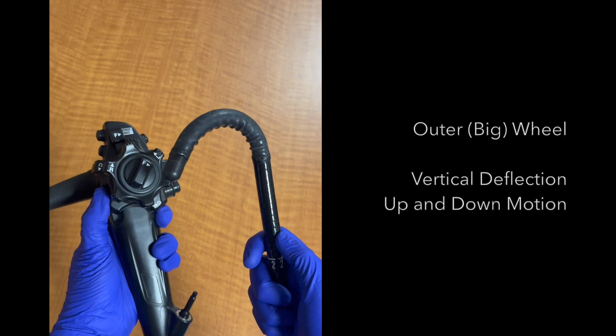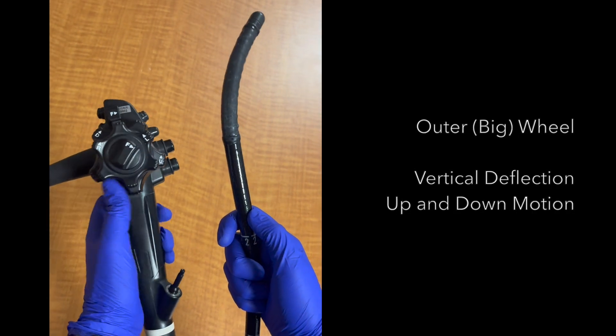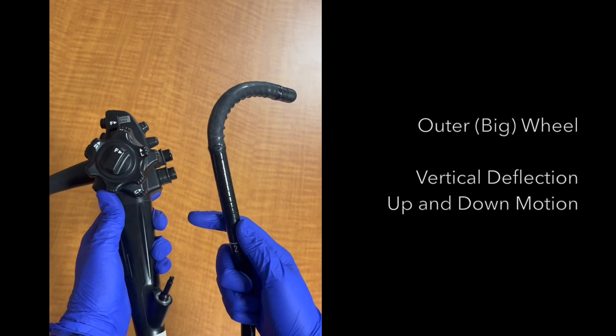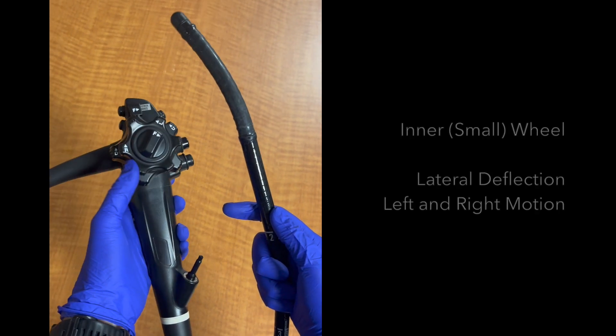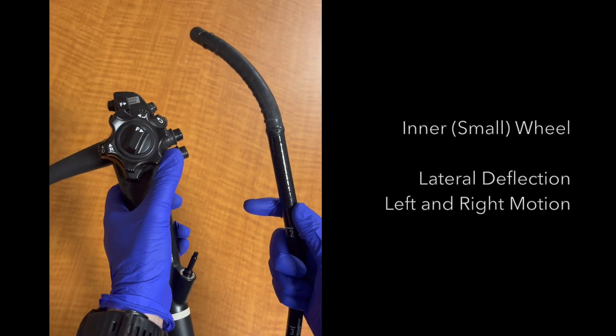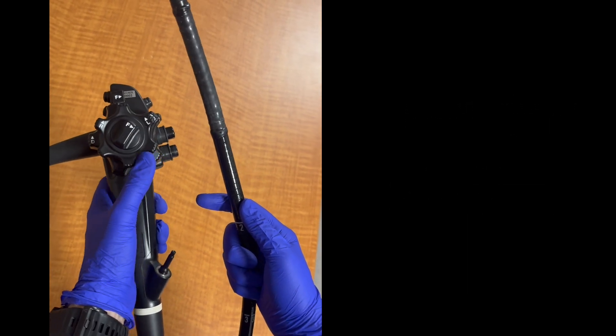This video demonstrates that the outer wheel controls vertical deflection, moving the tip up and down. The inner wheel controls lateral deflection, moving the tip left and right. The wheels can be used in combination.